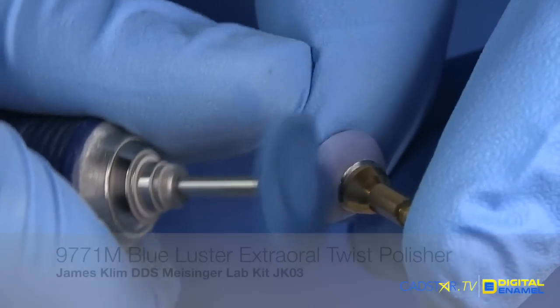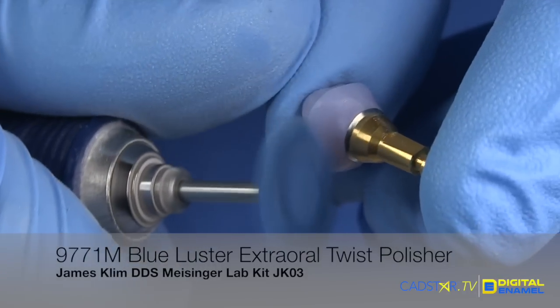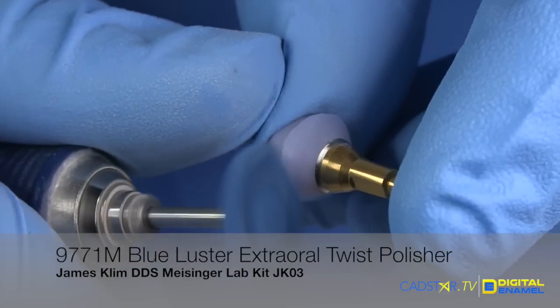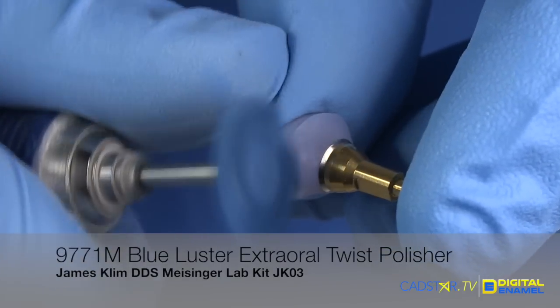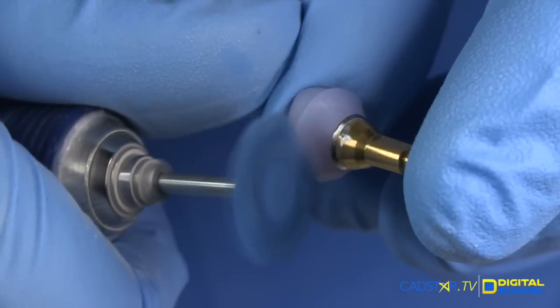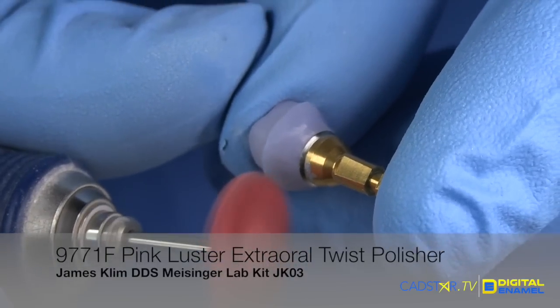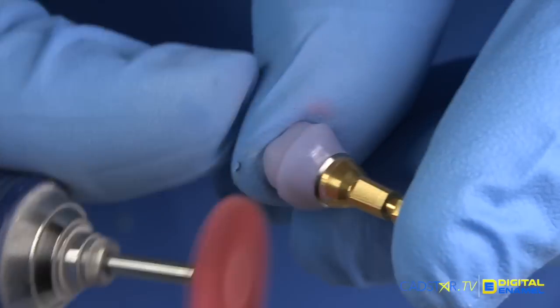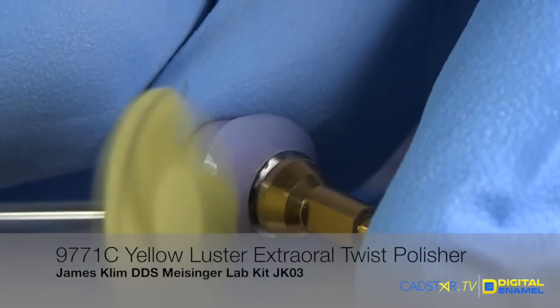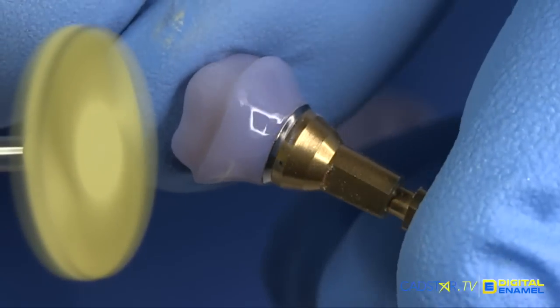We'll complete the polish of the sub-gingival zone of the abutment. We've already used the green and the blue knife edge wheel and the green twist. Now we're going to go with the blue twist — the blue luster twist, the Meisinger luster twist. It's so forgiving. You want to use a light pressure. Then we'll progress to the pink, a higher luster twist finish, and then finally the yellow luster twist polisher. That is a really nice finish this provides — as good or better than a diamond paste.